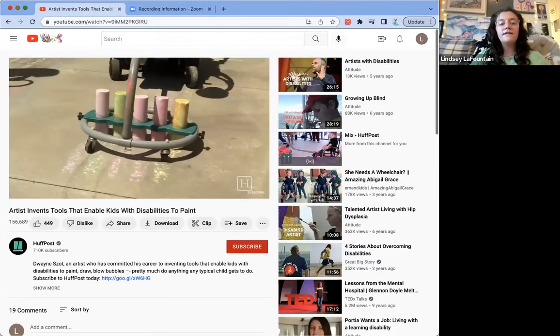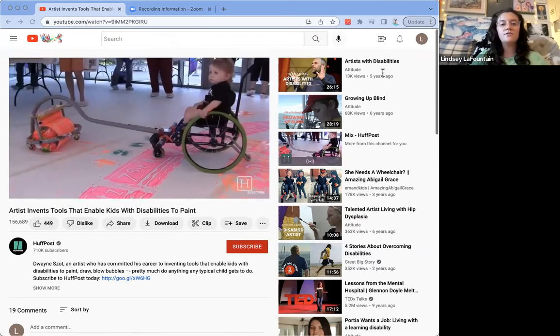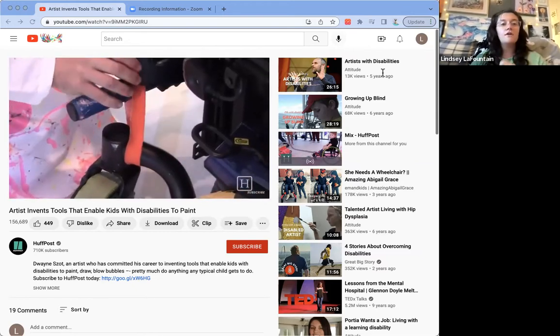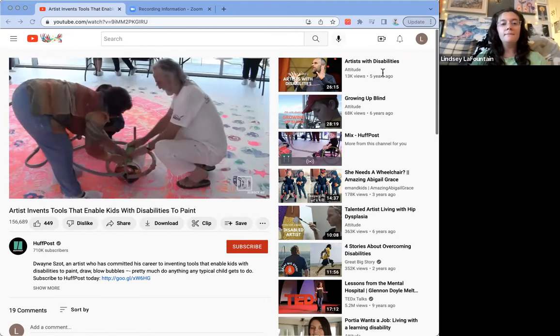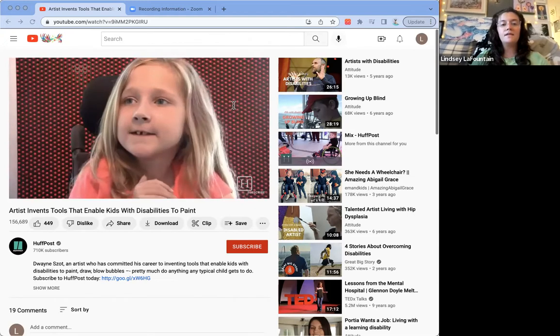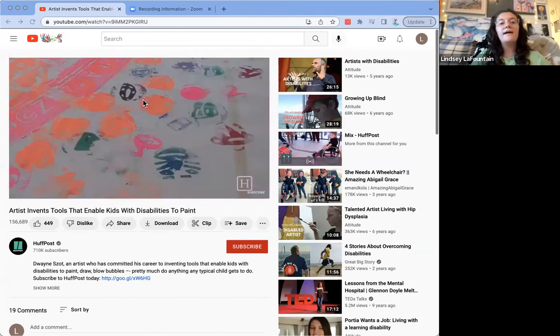So let me share my screen. The device that you're about to see is a wheelchair paintbrush that is created when PVC pipe is formed into a bridge shape. There's a large version of a foam roller in the halo part of the PVC pipe, and at the top of this device, there's a tray with paint inside that continuously wets the roller to allow for endless painting.